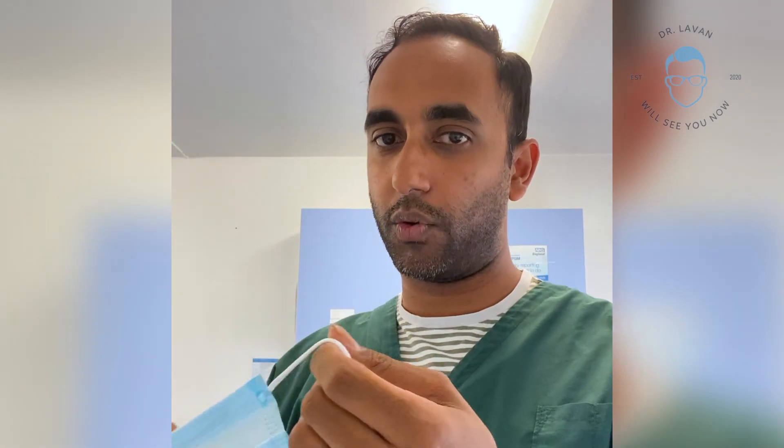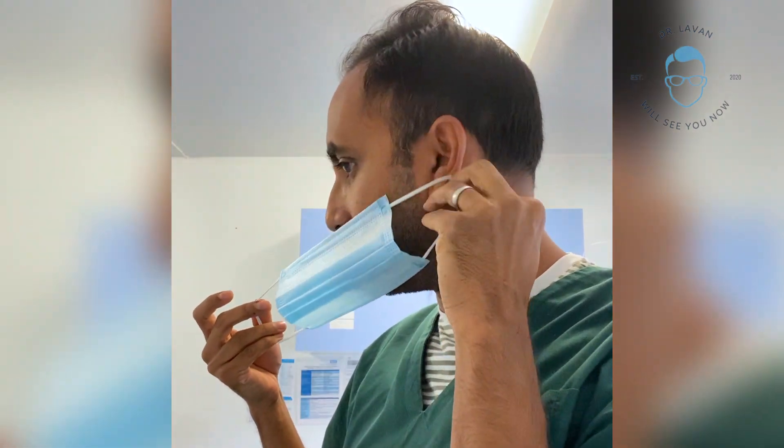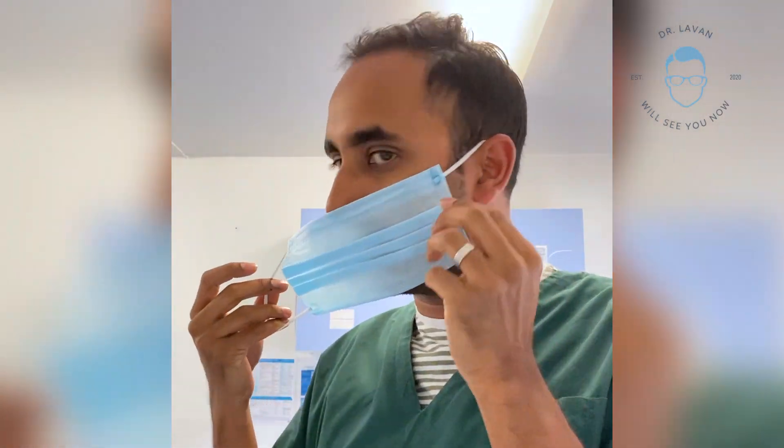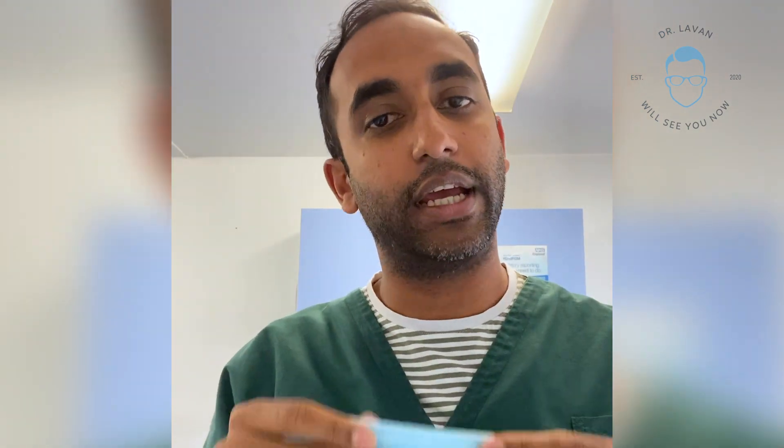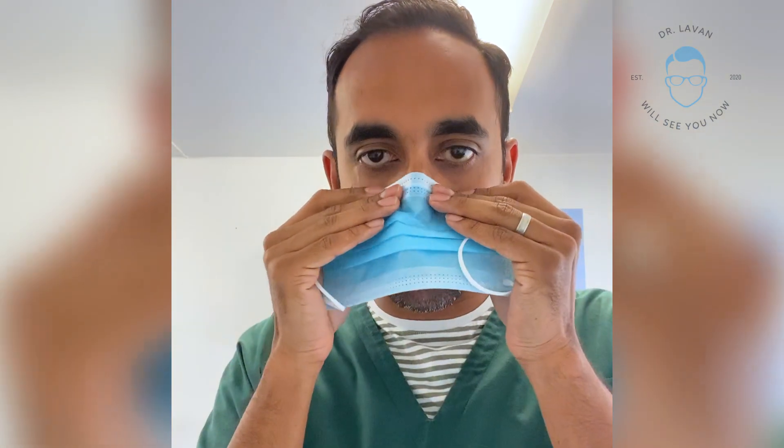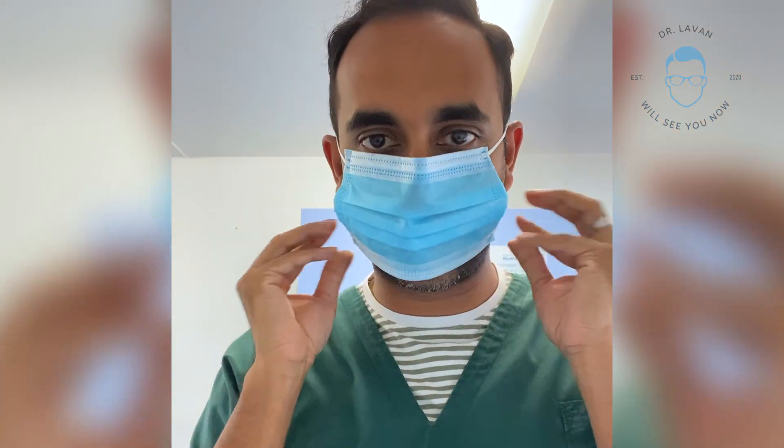The second one is the ear loop — quite nice and easy to use. Just place it over the ear and on the other side as well. Remember here again it has to be the more coloured side. It's difficult to see on this video but this bit here is the more blue side, so this would go on the outside — coloured side out, placed on like this.